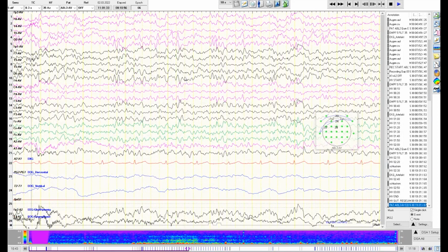If you breathe too often, you get a little bit drowsy because all your acid goes out, and you get the opposite of acidosis, and then you can get some generalized slowings. However, if you have focal slowings, then of course this is some kind of pathology.